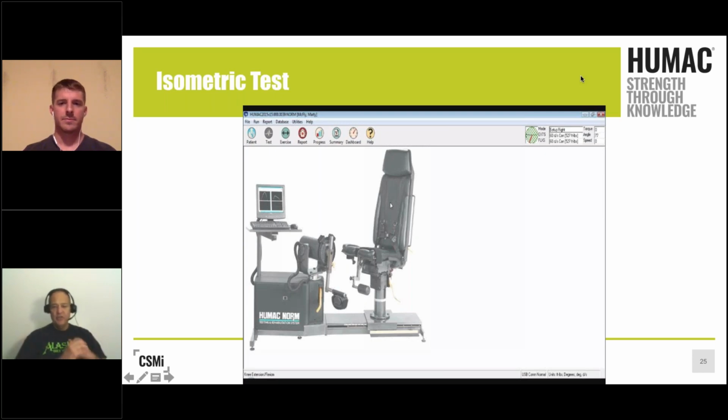I like the fact that you talked about our balanced patients because that's one of the areas that we really need to pay attention to. So I want to look at, are they actually functioning and producing the correct torque ratios through the range of motion so that they're aligning both concentric and eccentric measurements and they don't have a deficit in the eccentric motor contraction, because that's one of the points that we really see, and it's actually been measured.